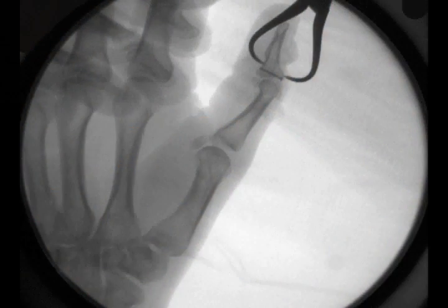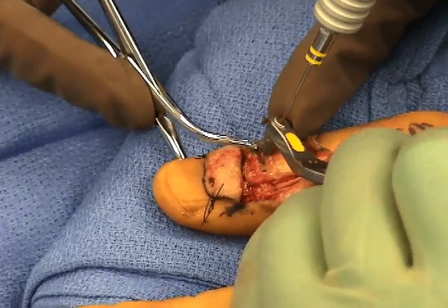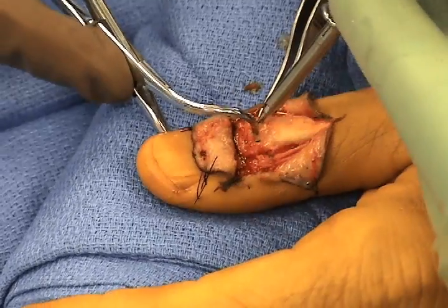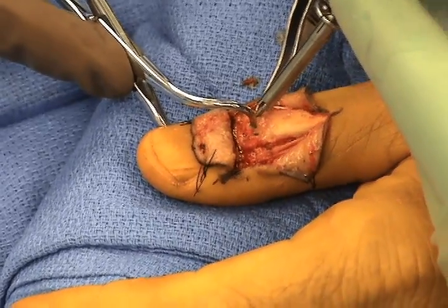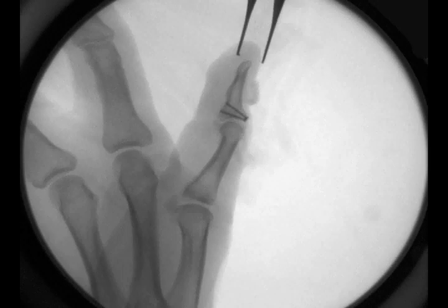In this case, one screw is applied on either side of the reduction clamp after first making a longitudinal incision in the tendon, so that the screw head can be placed directly down to the bone of the distal fragment. X-rays confirm anatomic alignment.